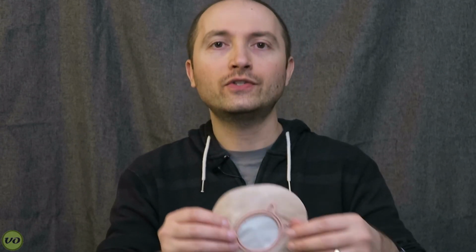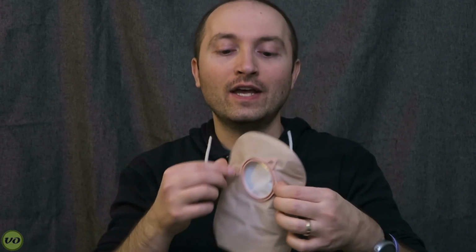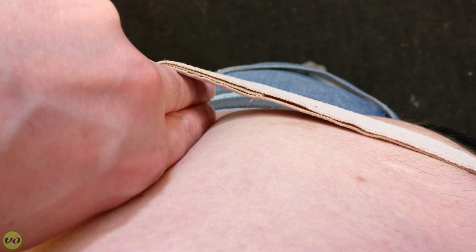And regardless of whether or not you have a convex appliance, never over tighten these belts. What tends to happen if you over tighten is that you may develop pressure sores or other kind of irritation. But also, if you have a belt tab on the side like this and it's putting a lot of pressure like that, you might actually detach the bag without even knowing. So keep that in mind when you're wearing an accessory belt. Don't make it too tight. One of my stoma nurses says, as a general rule, make sure you can stick 2 fingers in between the belt and your skin, and that should be more or less the right tension.